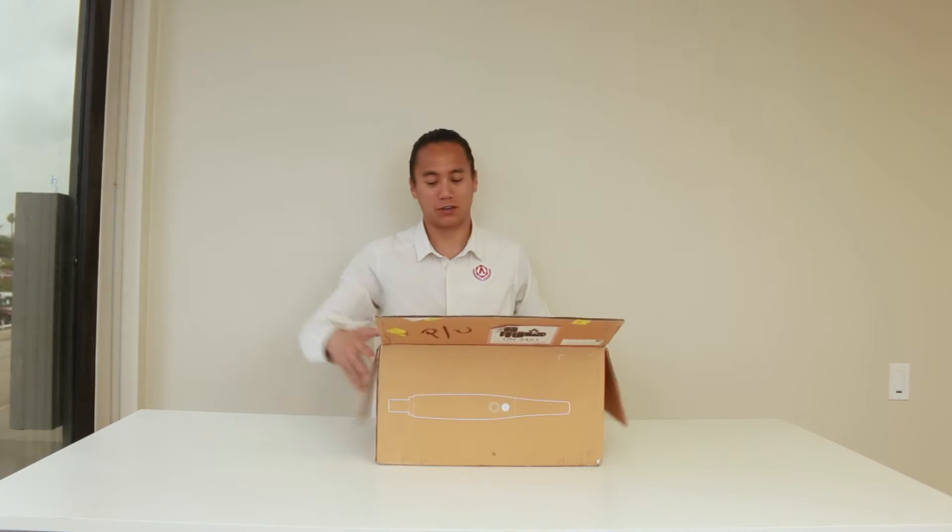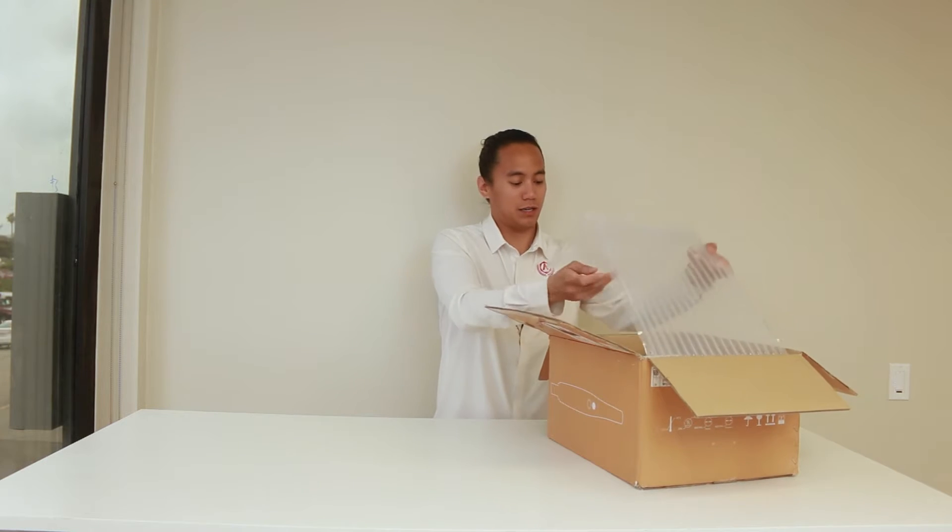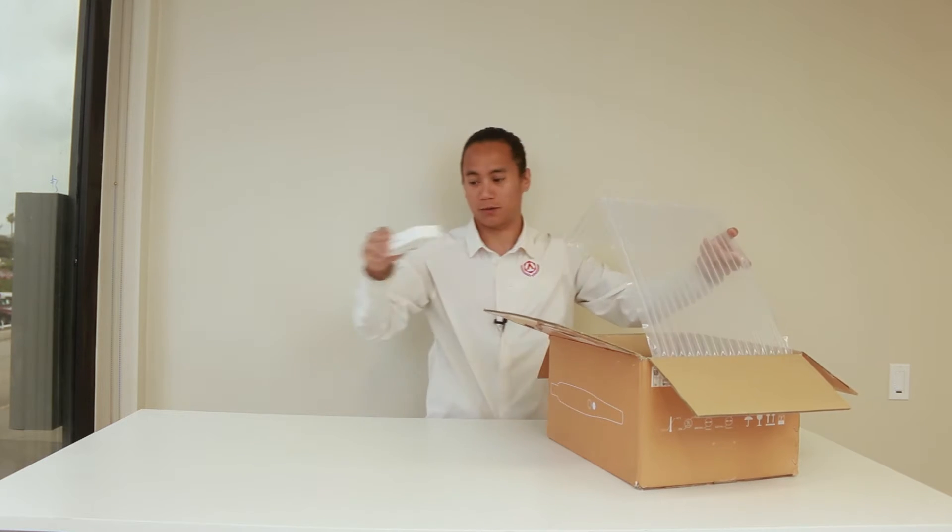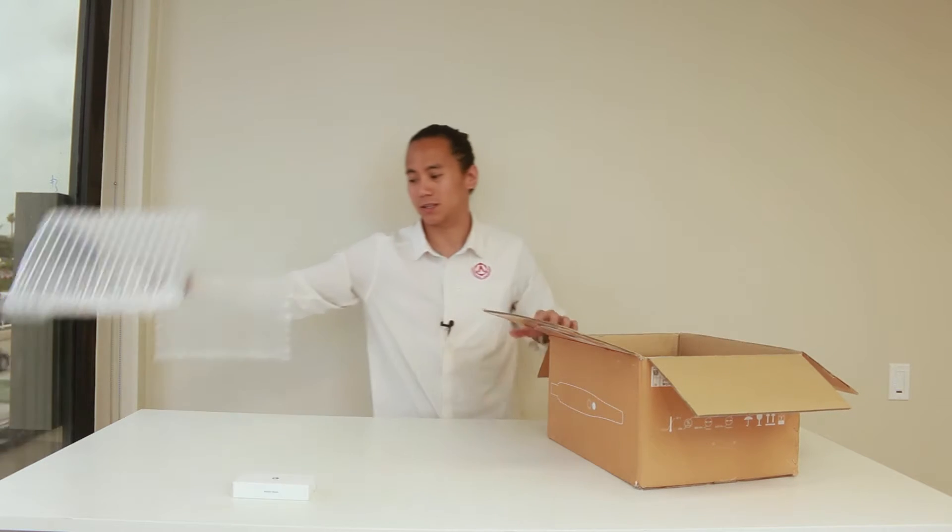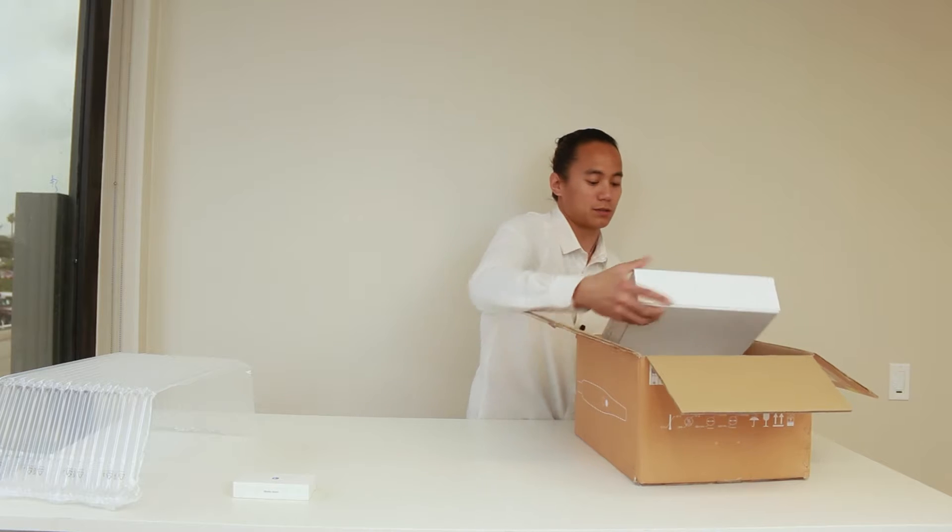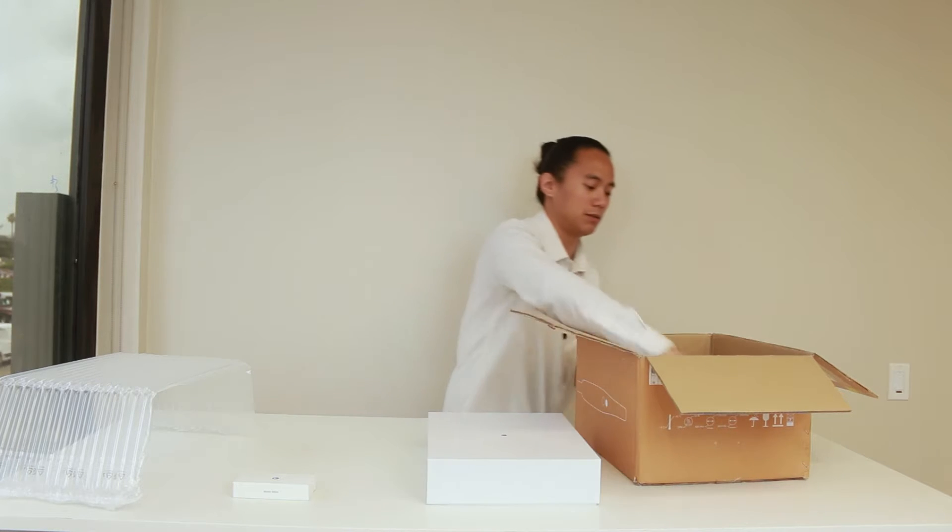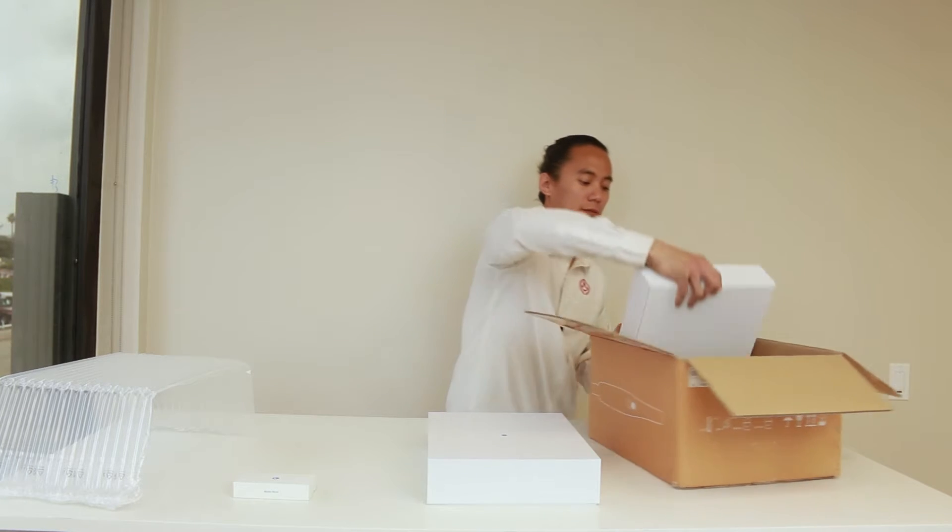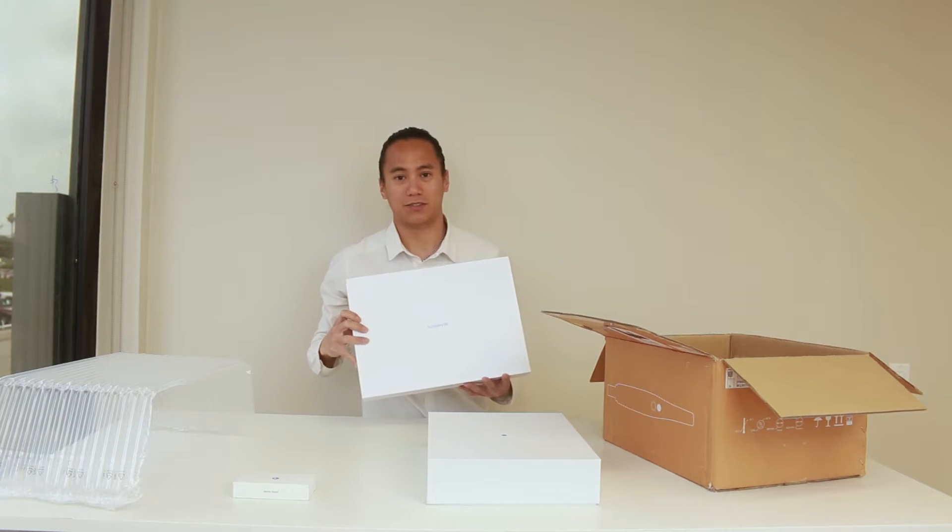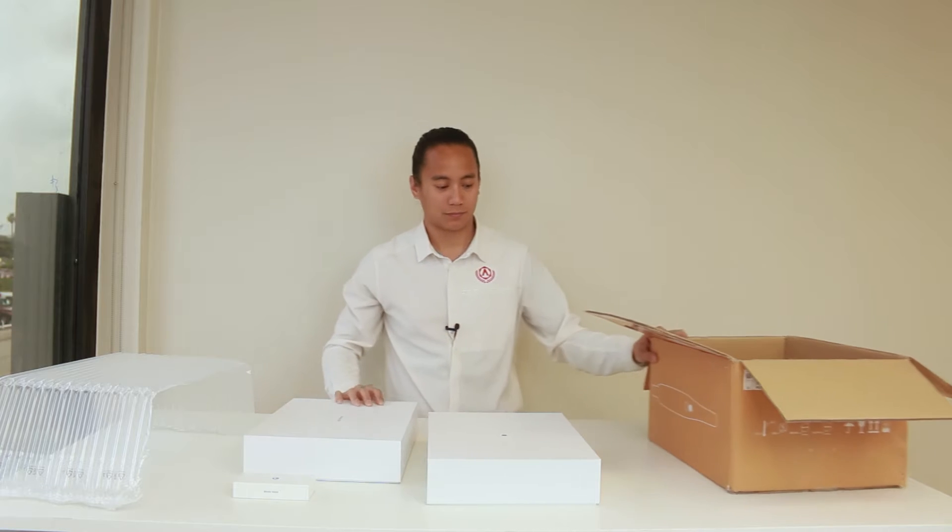When you open the box you're going to notice the first thing is the monitor mount. Put this to the side. The first box is the intraoral scanner and then we have your accessories kit. Let's go ahead and go through all the components.